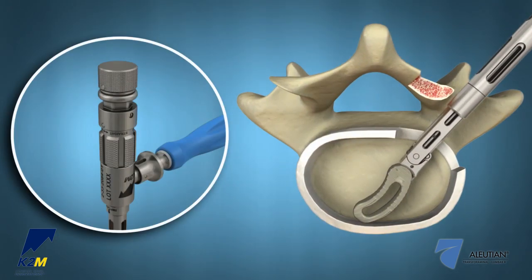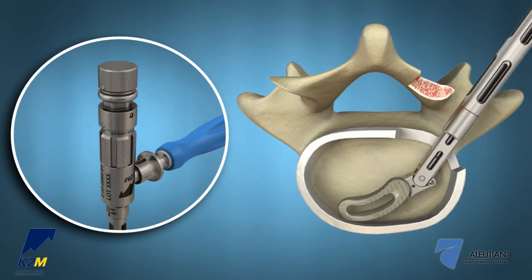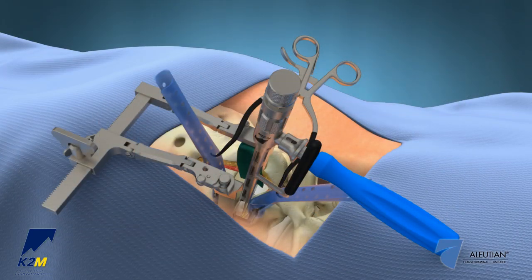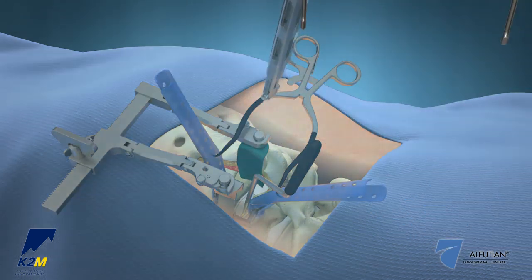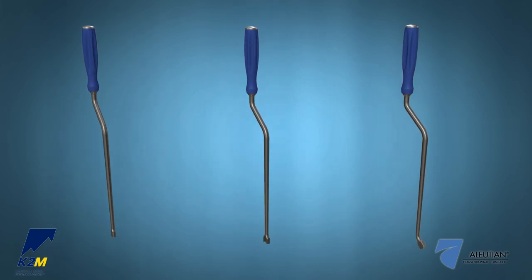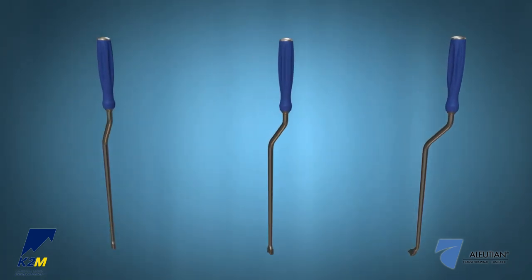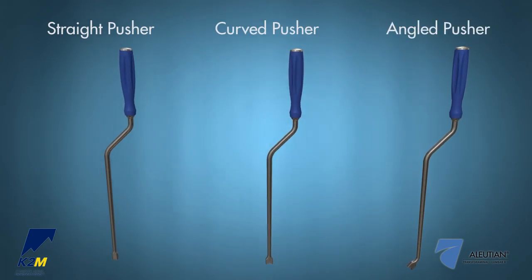Insert the implant into the disc space. Once proper placement is confirmed, disengage the implant by turning the inner shaft knob on the proximal end of the inserter counterclockwise. Completely remove the inner shaft once insertion is complete for cleaning. A variety of pushers are also available to aid in final placement of the interbody. The pushers come in straight, curved, and angled options.